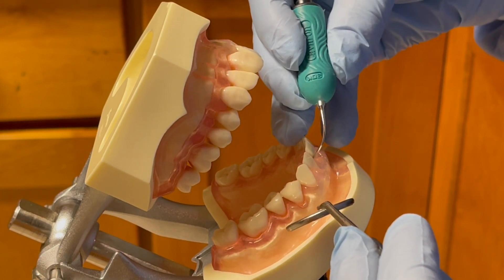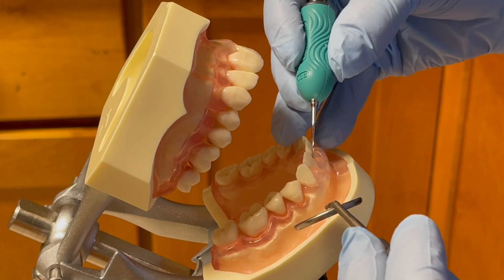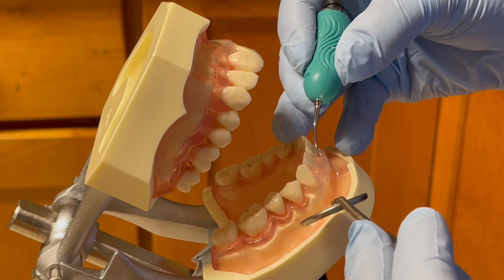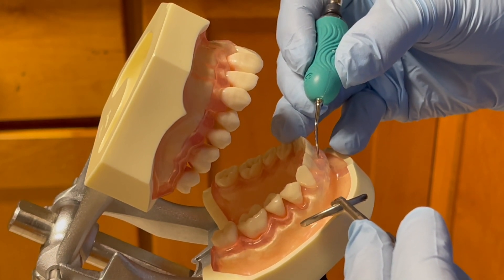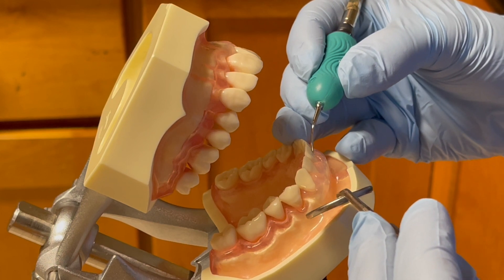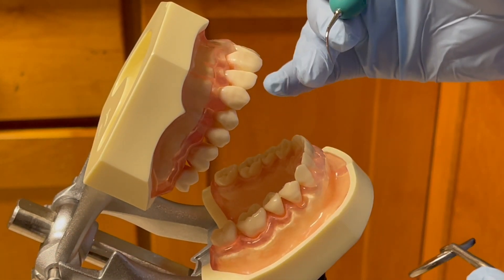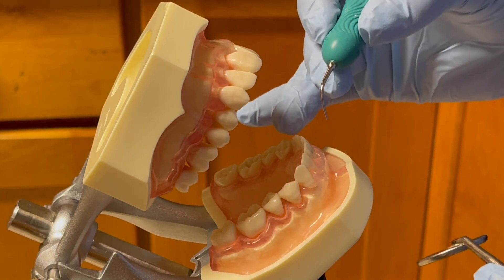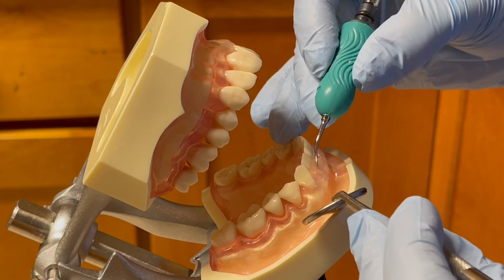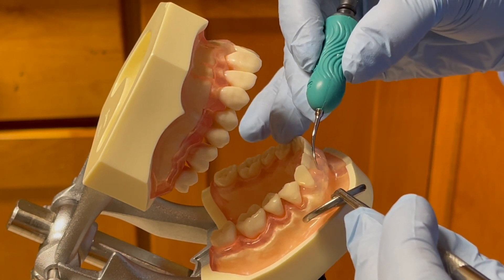Then I drop my handle again with the face of the tip adapted to the tooth, continue using vertical strokes, then change to vertical adaptation of the tip with the side of the tip adapted to the tooth, and repeat the same procedure, working the tip from the distal interproximal to the mesial interproximal to finish the facial and mesial area. I will do the same procedure for the facial aspects of number 26.